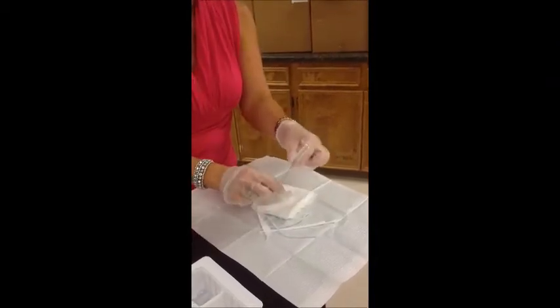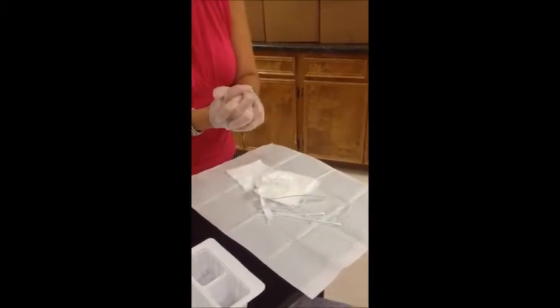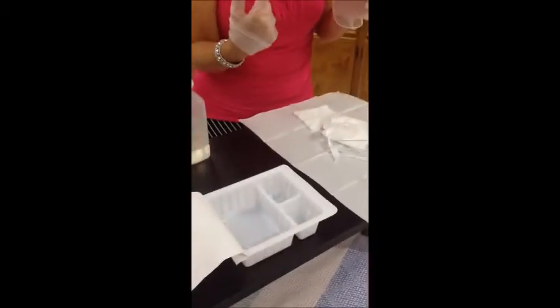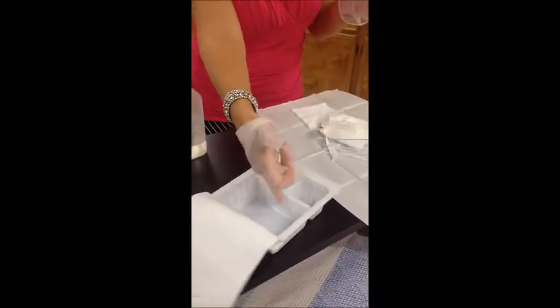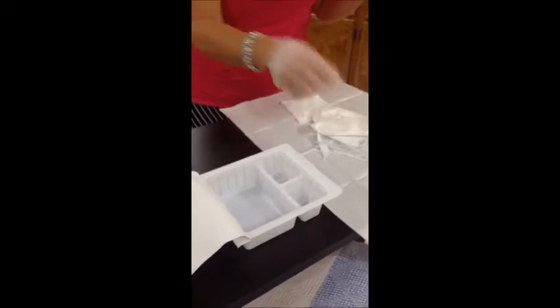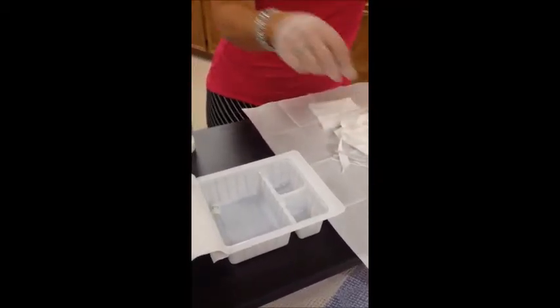This is my little cleaning brush, pipe cleaners, and some Q-tips. This over here has been bubbling because we've got it in the half peroxide, half saline. And so I'm ready to clean it. My patient's doing fine, got his O2 on, life is good.